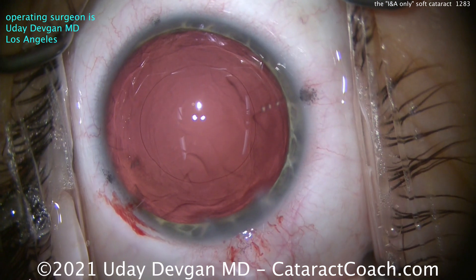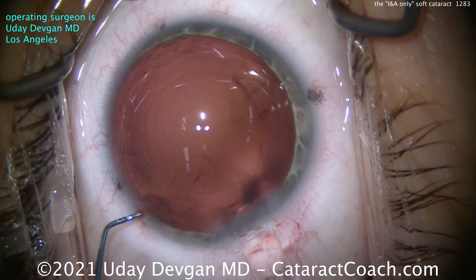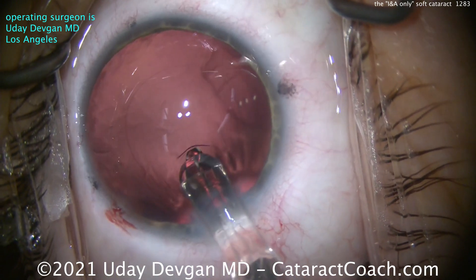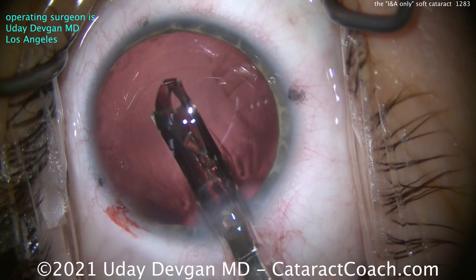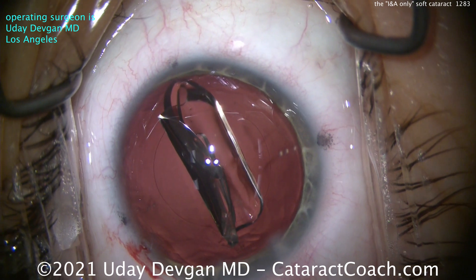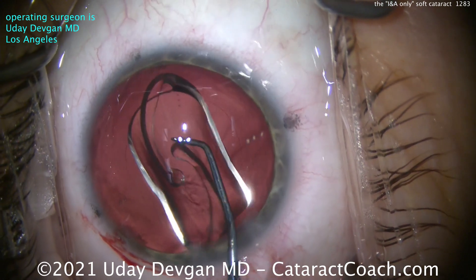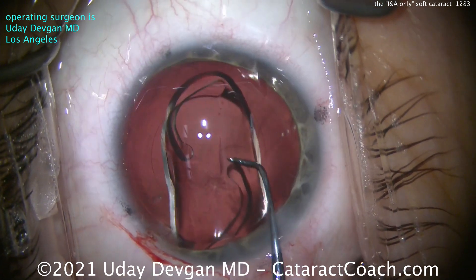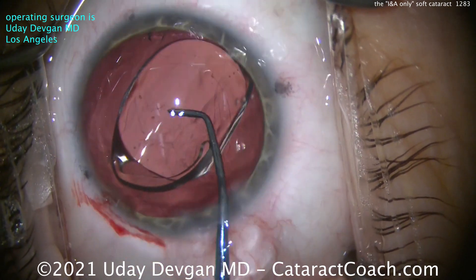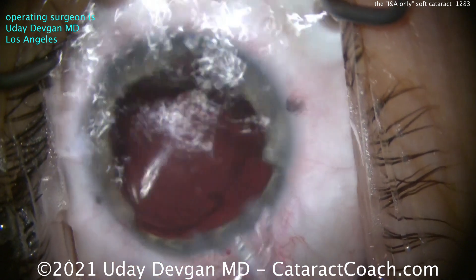So filling up our capsule bag here — we're going to put in a toric lens. You can already see some toric marks on the cornea at about the with-the-rule or 90-degree meridian. Here comes the lens going into the capsule bag — nice and easy on that delivery. We'll get this toric lens lined up for this patient. Now, the question for you is: the patient's 30 years old and has accommodation — what do you choose as the refractive target in this eye? Plano or a little bit of myopia?